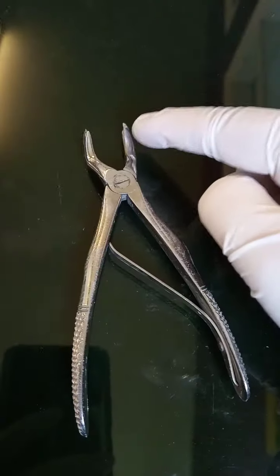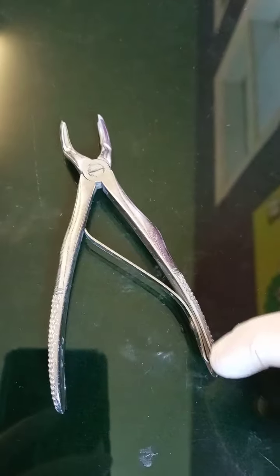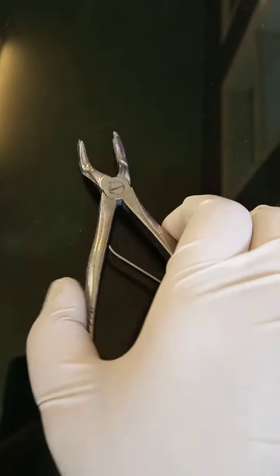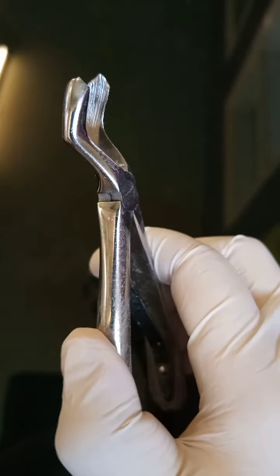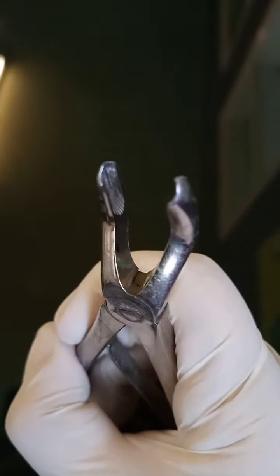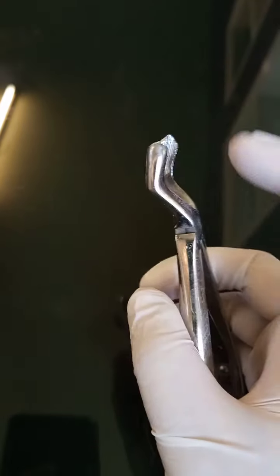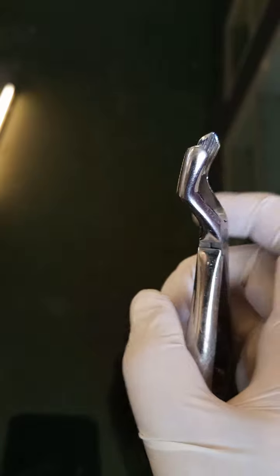Now the forceps shown is also used for the upper D's and E's. It has same parts: the beaks, the hinge, the dental spring, and the handle. You can clearly see that the beaks are usually serrated and have pointed edges. It is used for a strong grip. It is used in a case when it is difficult to extract D and E with regular forceps.